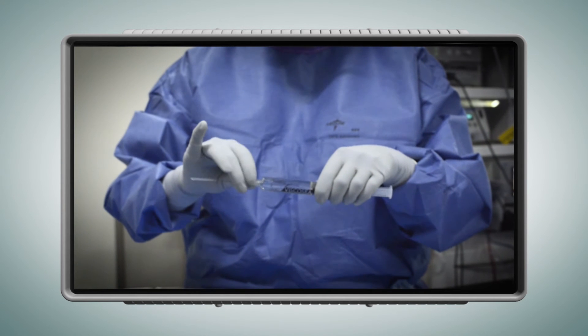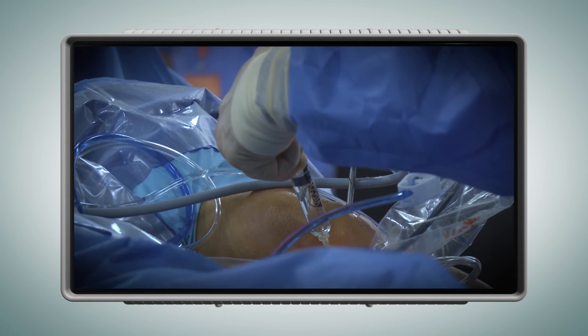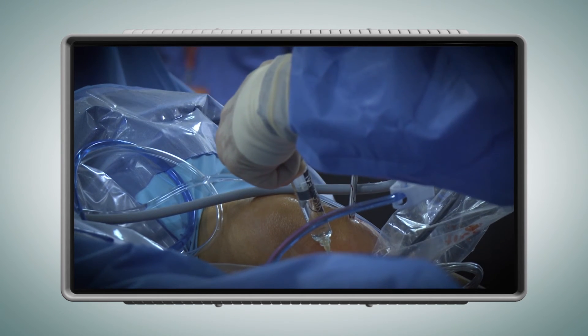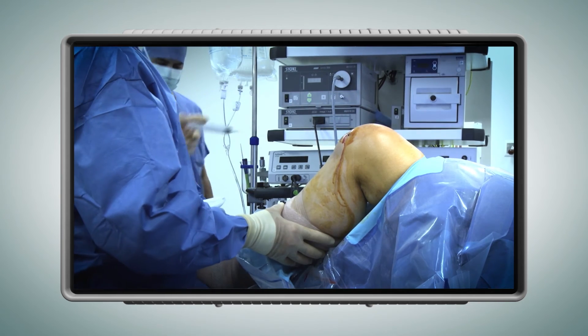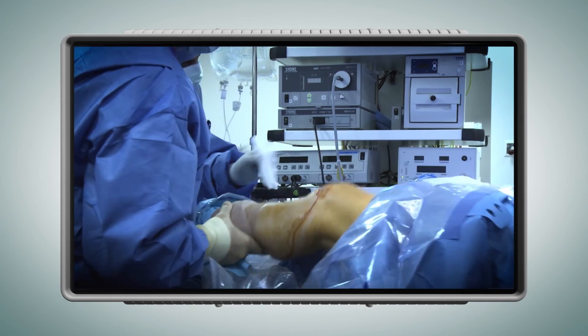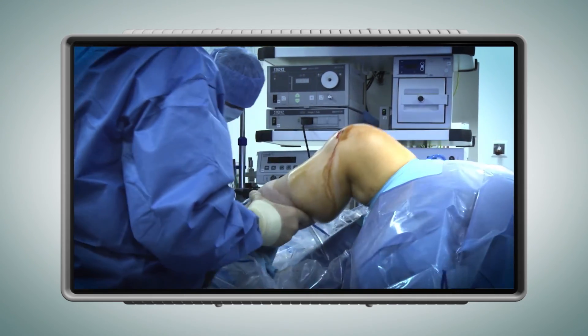Once the irrigation fluid is evacuated, Viscoseal can be directly injected into the joint through any portal under arthroscopic control. The joint is then moved, which allows Viscoseal to distribute evenly throughout the joint, coating the synovium and the joint surfaces.